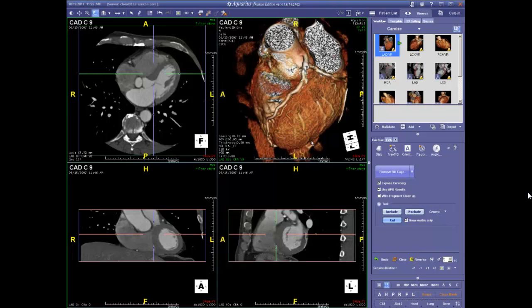Cholesterol profile was favorable. She didn't smoke, etc. Wasn't a diabetic. Not particularly active, had been a little on the heavy side and had lost some weight, but was worried because she'd had some chest pain that was unexplained by a couple of emergency room visits where her EKG and enzymes were normal. So she was sent out to see another physician to work this up. And this study was done about 3 weeks after she'd been to the emergency room and worked up without actual stress testing. I'm not sure really why this was ordered in lieu of a stress test. But let me jump right into these issues here.